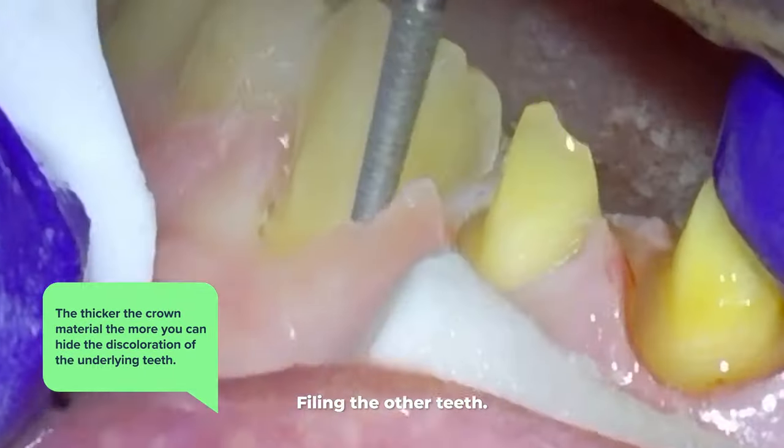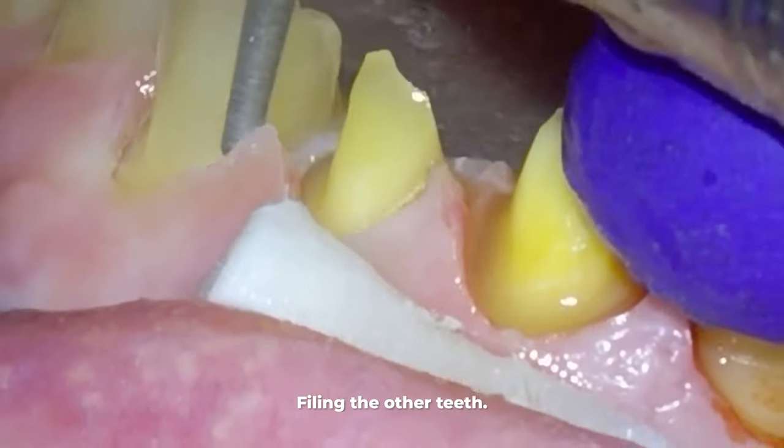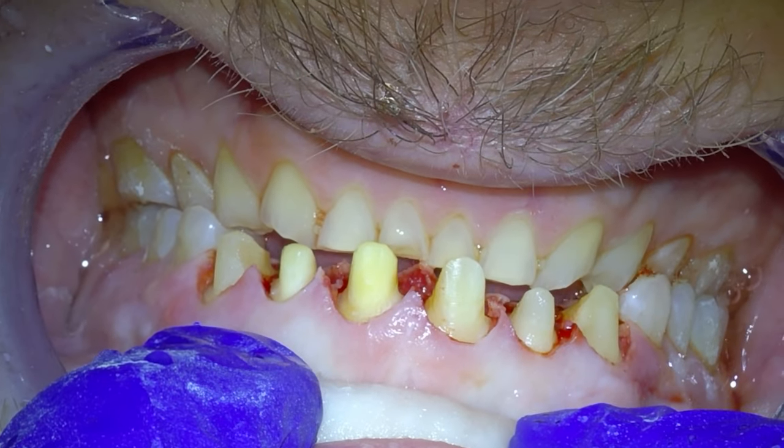So there's some give and take — you have to file them down enough, but not too much, because if you file them down too much, they can possibly break down the road as well. This is what the teeth look like when we are done filing them down.